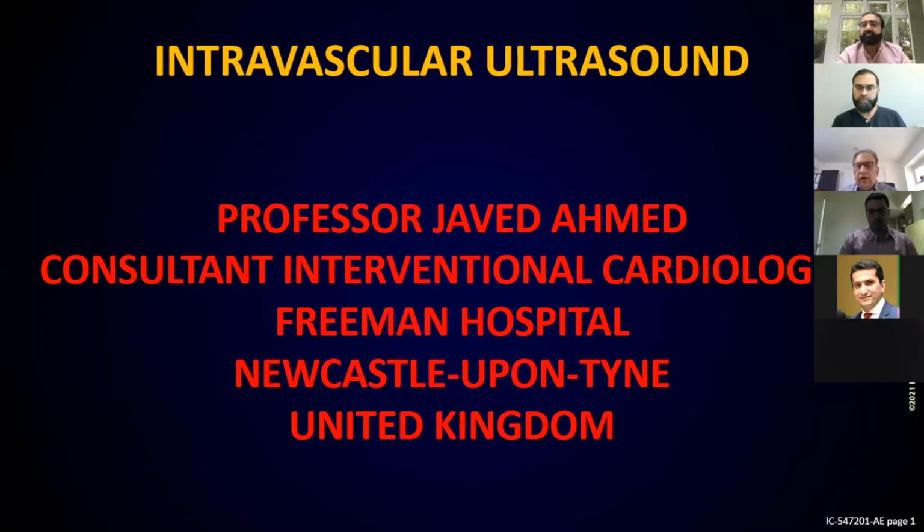Ahmed, thank you very much for inviting me to deliver a talk on intravascular ultrasound. I'm grateful to APC and the very elite panel members, including Suhail Khan, Shazia Hussain, and Farhan Shahid. My talk would be on different aspects of intravascular ultrasound. It is a huge topic, and it would be very difficult to cover everything. But I will try to start with the basics, and then after that, we can have some case discussions on the basis of case histories.